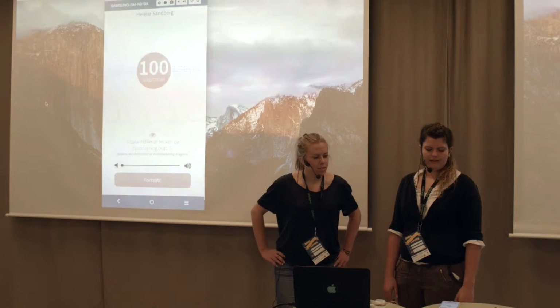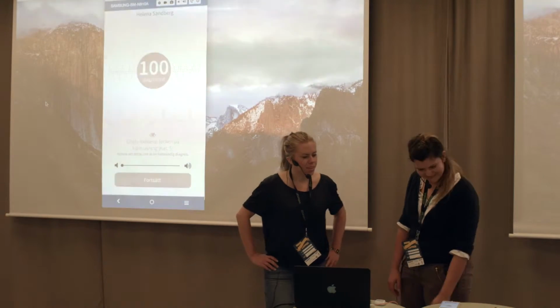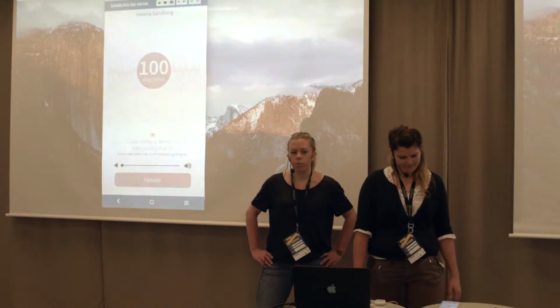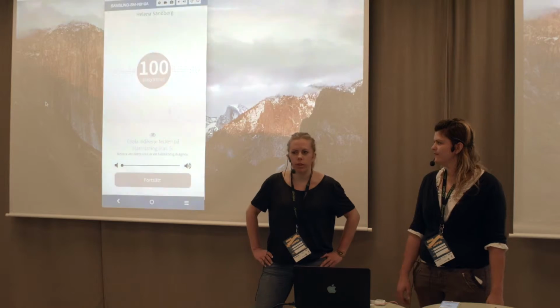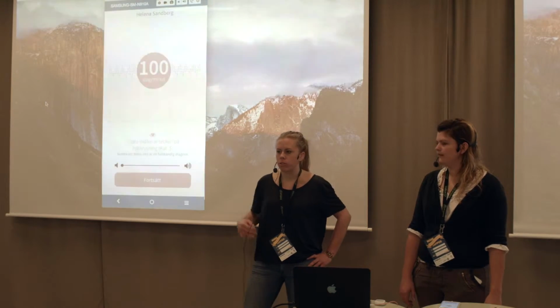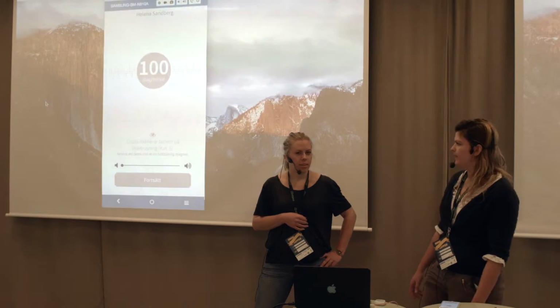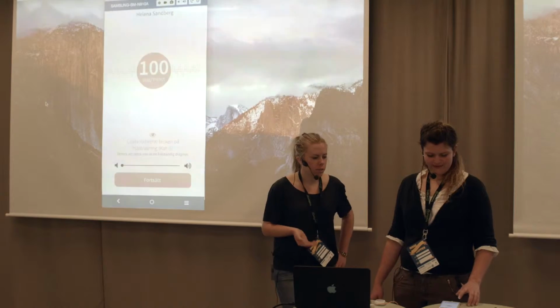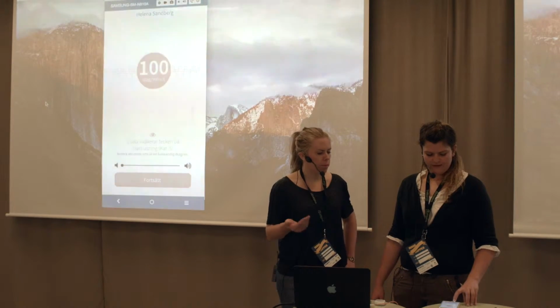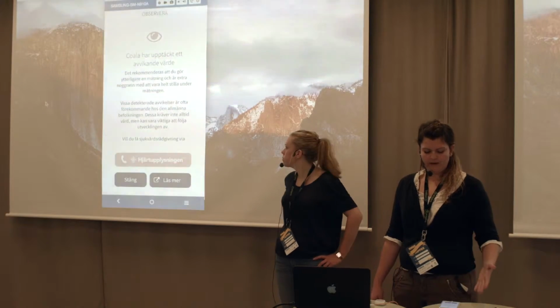I don't have a very good result, I see. No, stressed. So what you should do when you have this product is to measure every other day or every week or so, just to see a pattern. And not in front of a bunch of people, maybe. No. But maybe it's good that we see this now. So now you will see what happens when something bad is detected. Yeah, so here you get some information.